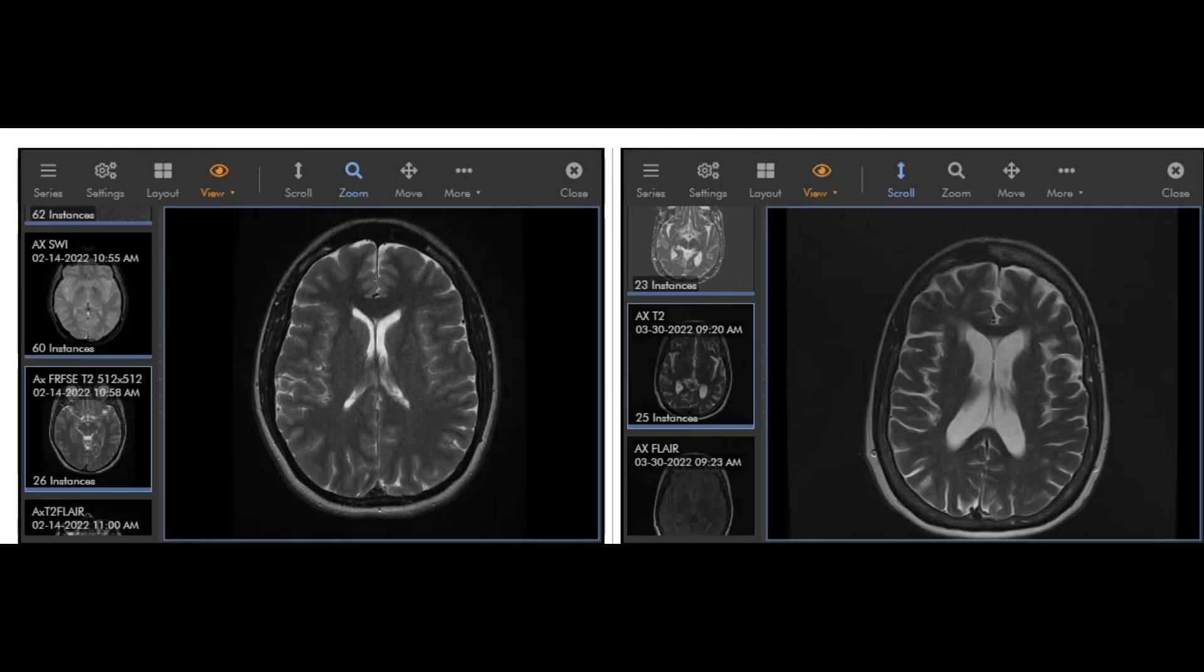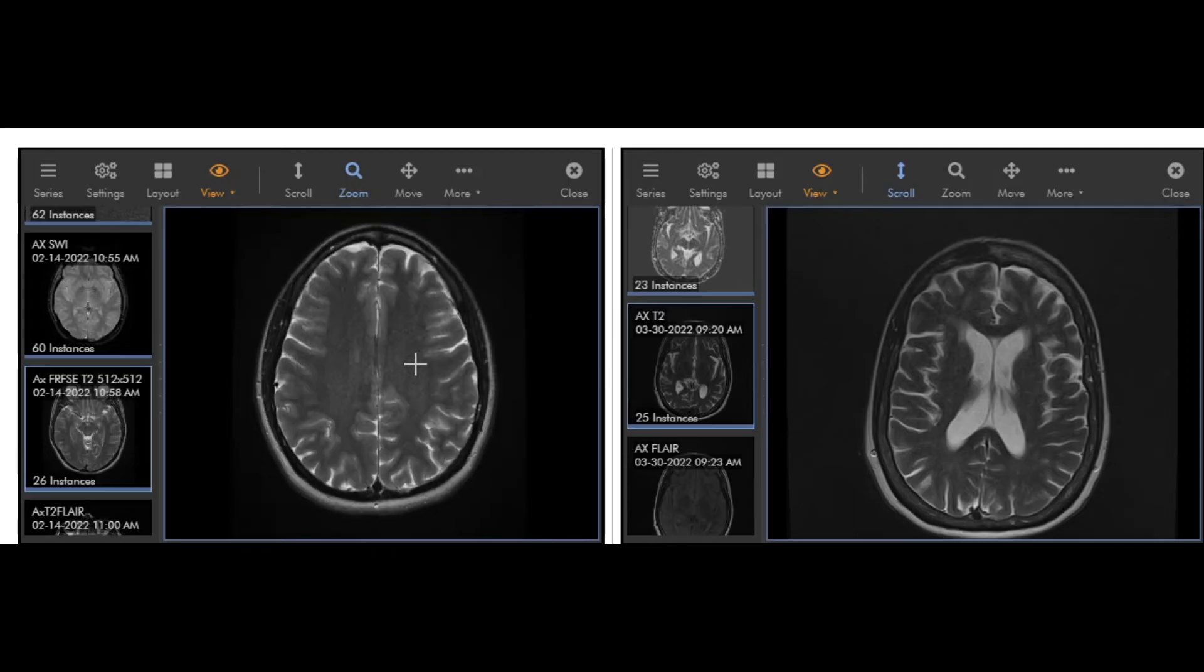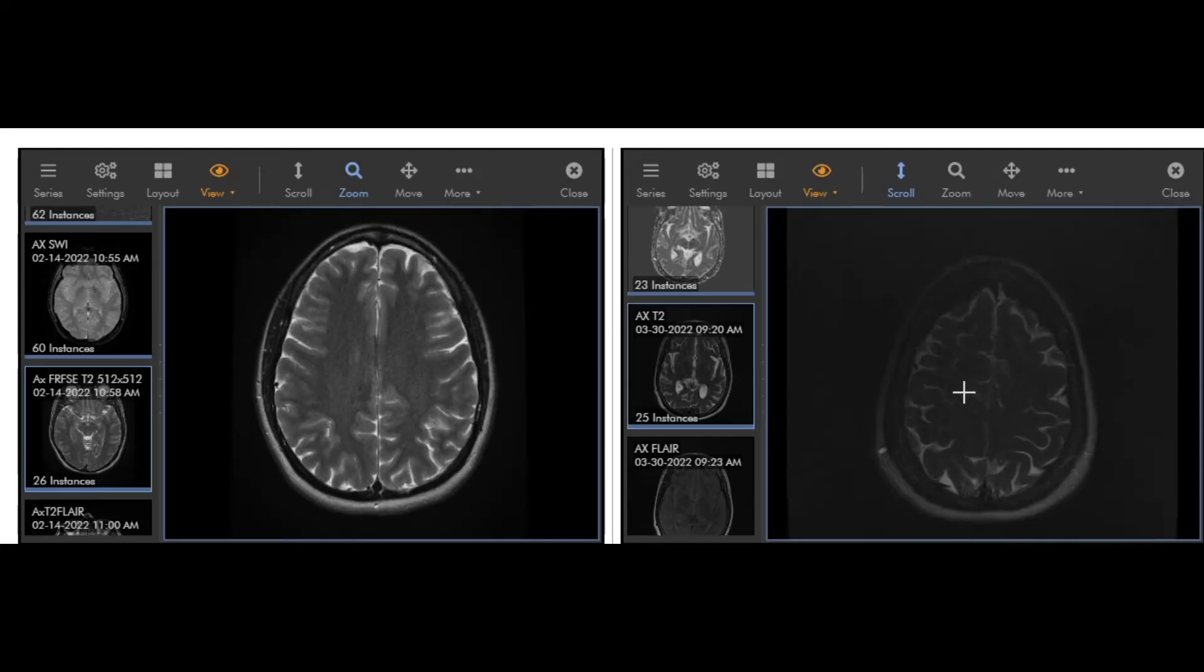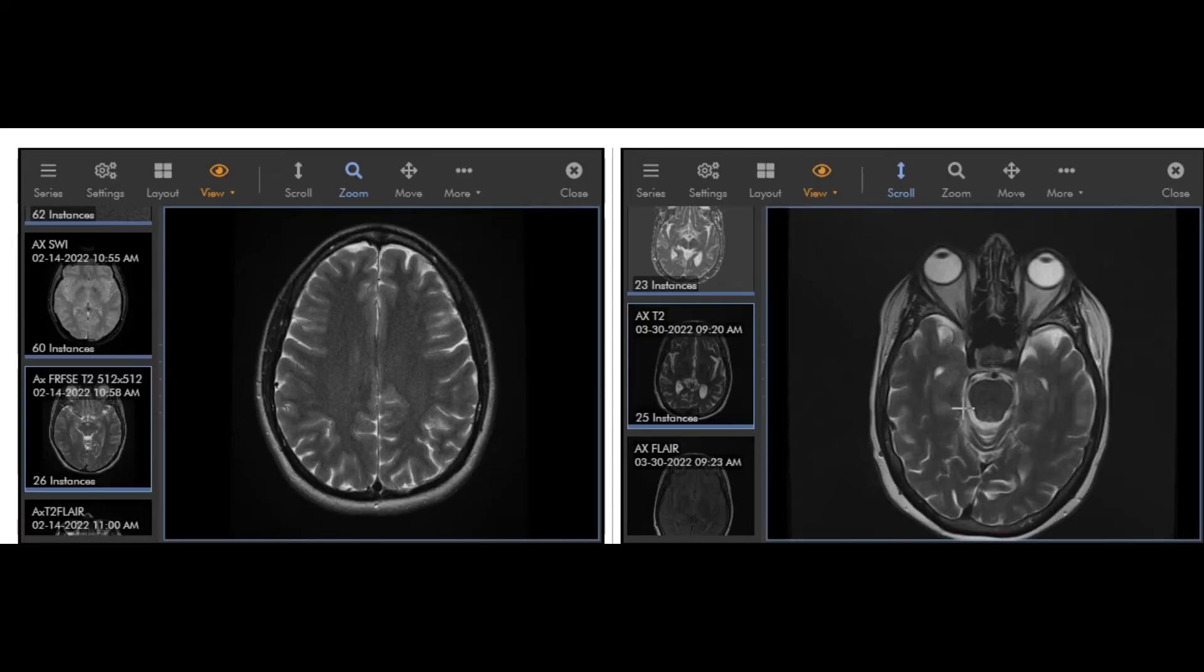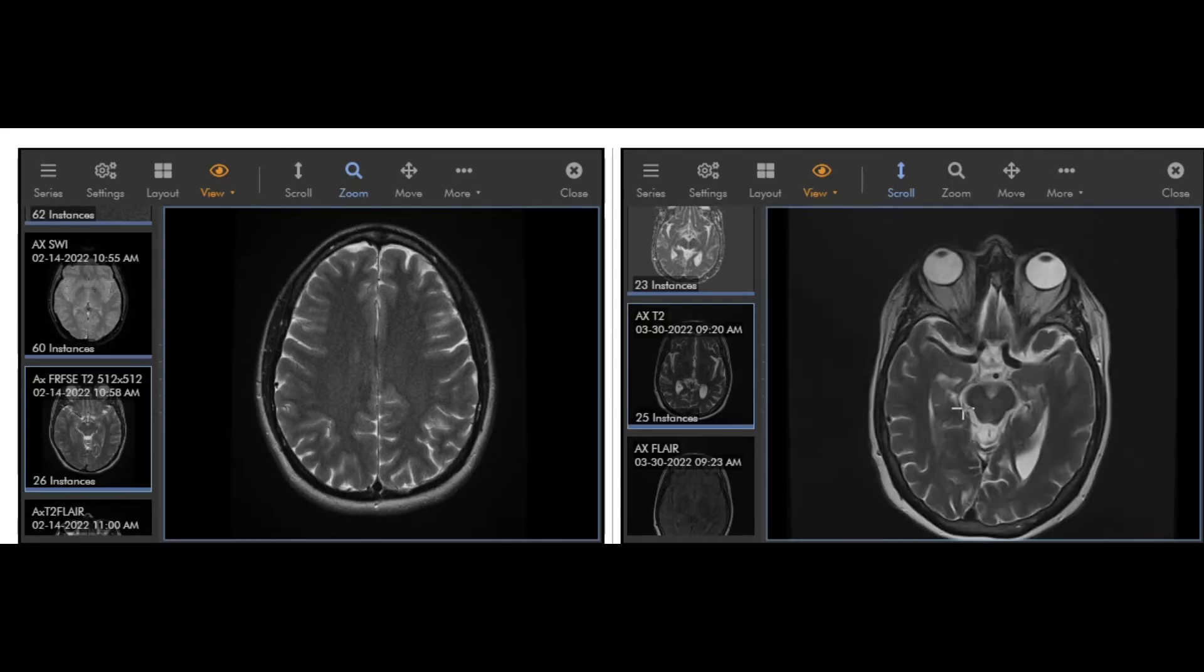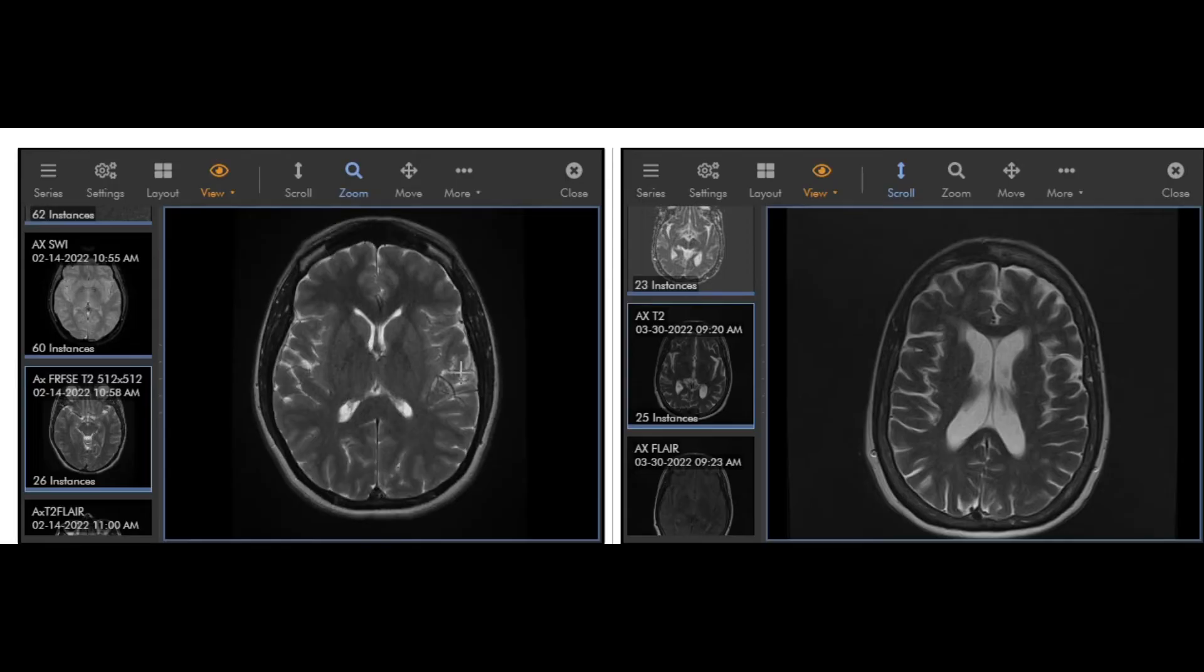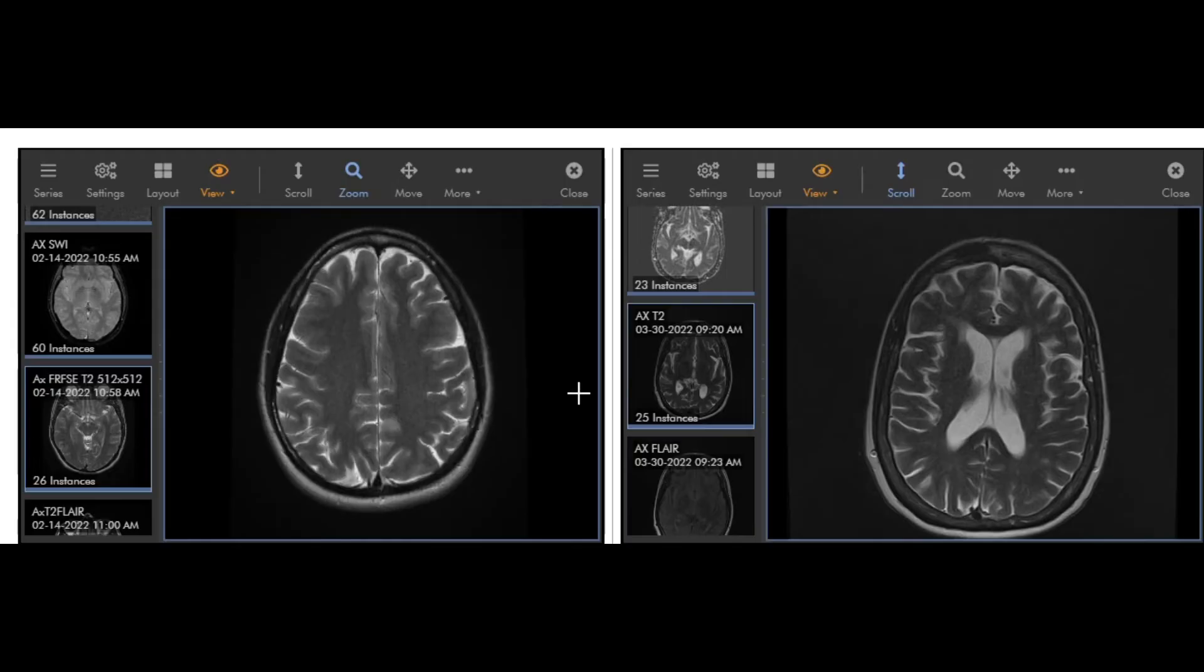So it's starting to overall shrink in size due to aging. And you can see even here in the middle, these are the ventricles where their fluid collects in the middle part of the brain. It's actually made here in the middle. And you see they're bigger too, which implies that there's been some brain volume loss here centrally as well. So overall, this brain has some mild generalized volume loss. So if you see that on a report, that's kind of what they're talking about is that basically the brain itself, just like everything else in our body will age and slowly decrease in size over time.